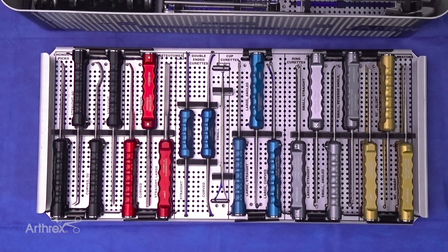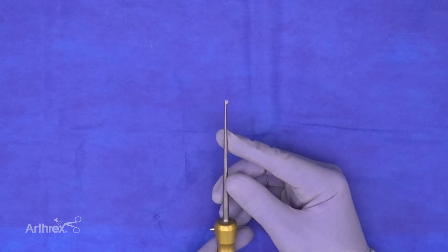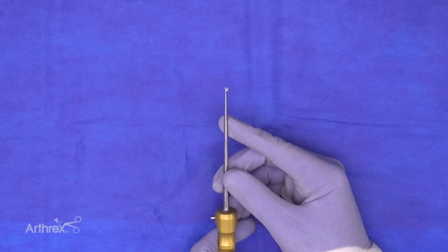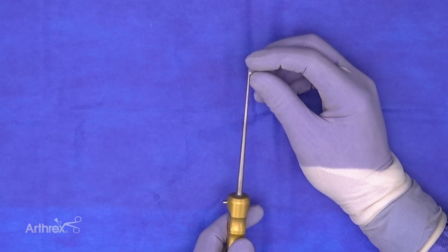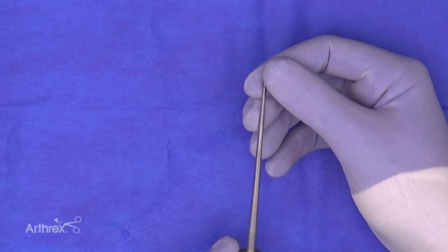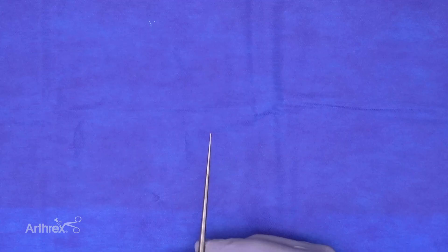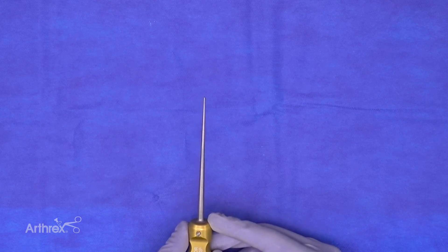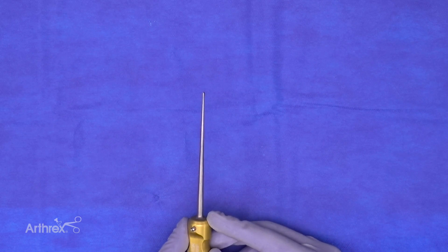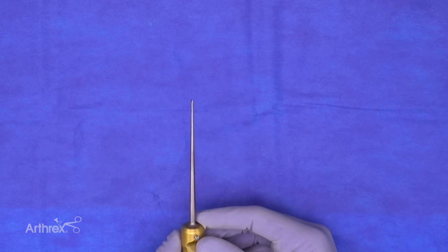Our gold-handled elevators round out the set. The workhorse is the sharp 90-degree elevator — very similar to the original paddle elevator from the first-generation arthroscopy set, but the working tip has been made smaller so it's much easier to introduce through the arthroscopy portal. This 90-degree awl is used to make the medial and lateral borders of the cartilage defect; since it cuts on both sides, the surgeon can rake in both directions to create a nice rim.